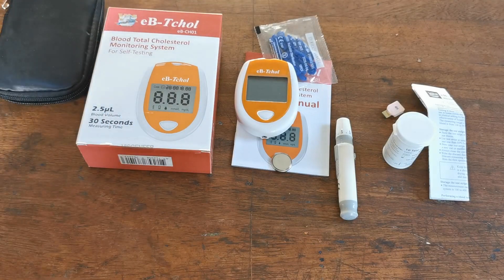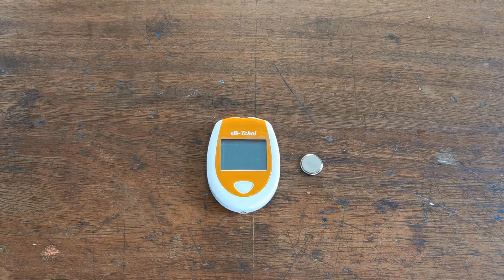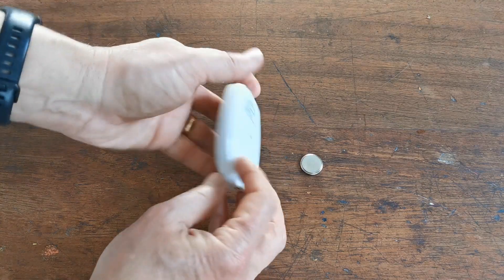In the next step, what we're going to do is put the battery into the meter and demonstrate how to set the time and date, so that the meter will record and store your cholesterol measurements. So let's put the battery in this meter and set it up.